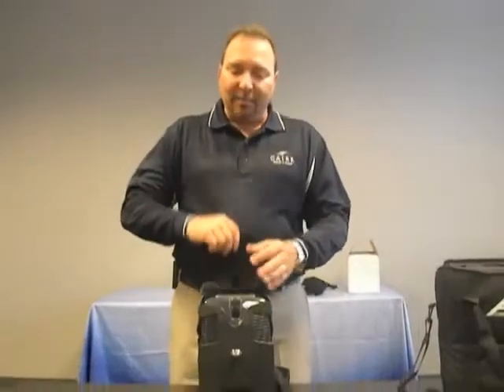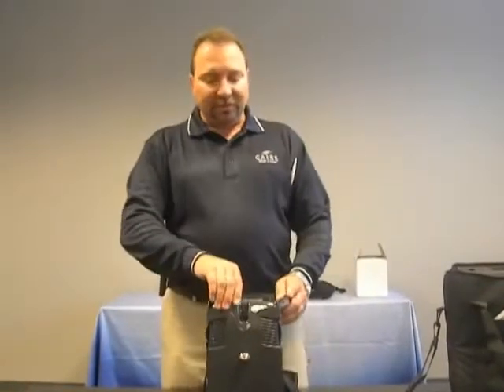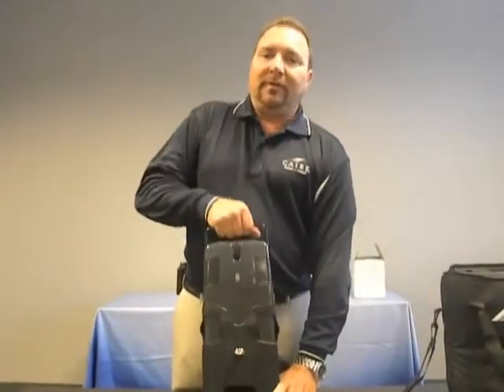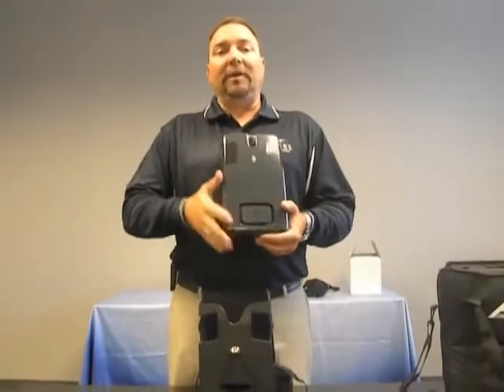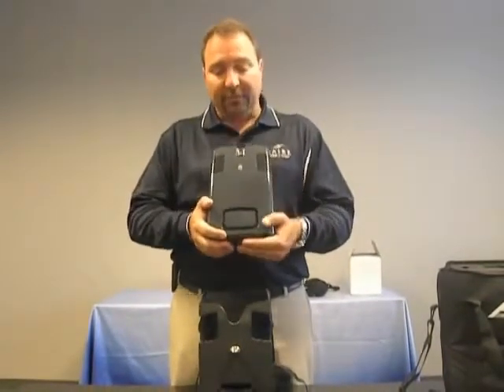Let's review the operation and maintenance of the FreeStyle 5. The FreeStyle 5 is a high-capacity, lightweight, portable oxygen concentrator that is easily wearable by the patient. The combined weight, including the internal battery, is 6.2 pounds.